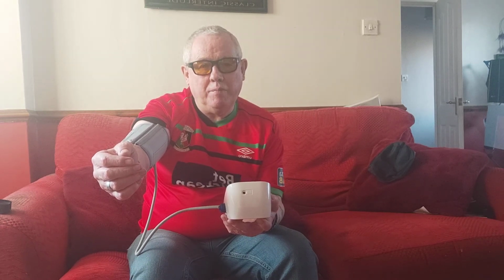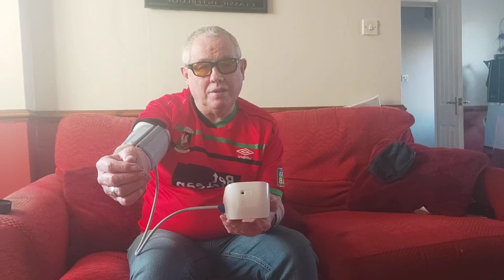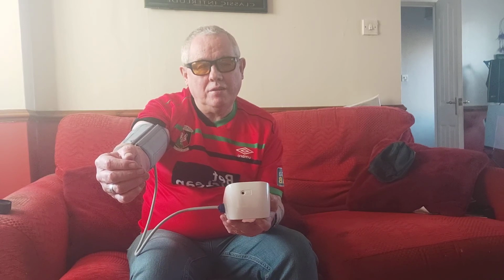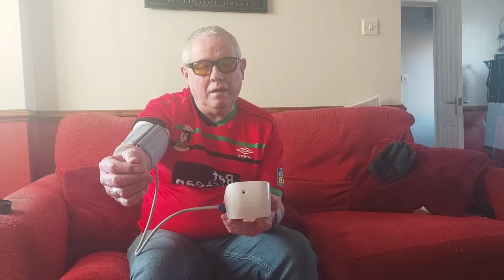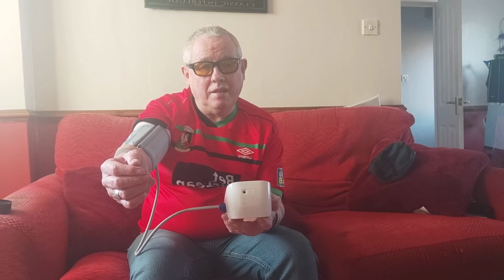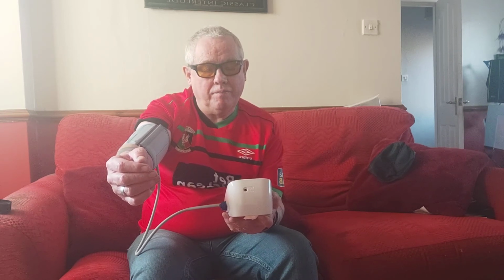I always have an idea of my blood pressure because sometimes it stops at 160, sometimes it stops at 180, and sometimes it stops at 210. Mine just stopped at 180, so I'm expecting my reading to be about 130 over 90. If it stops around 160, you know you're going to get a good blood pressure reading. And if it goes right up to 210, it's a high one.